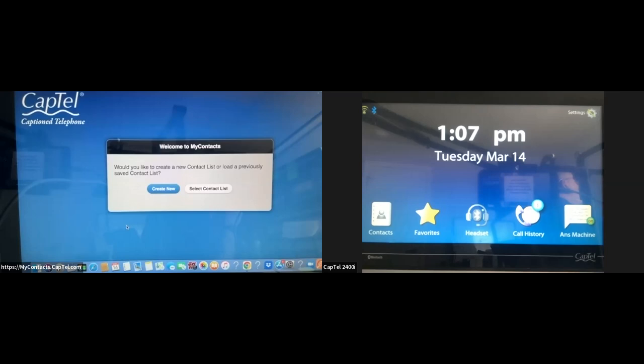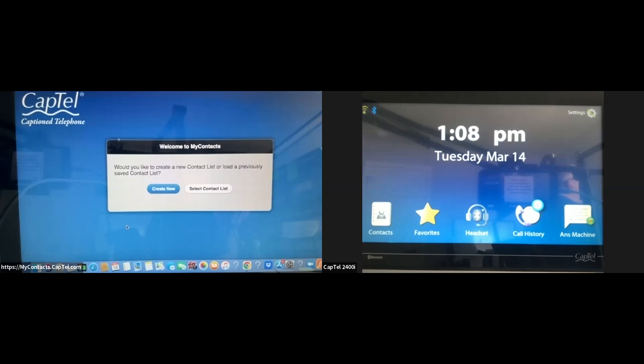Getting started is really easy. We just need to go back and forth from your phone to your computer because we're going to integrate and sync the process. The process is really easy, and I'm going to show you a few steps on how we can do that. The CapTel display screen will prompt you what to do next — it's really self-explanatory.